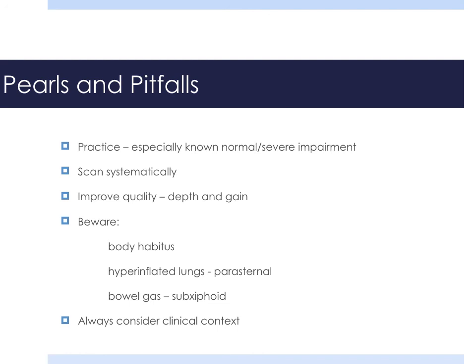Always consider the clinical context. Your scan should be triggered by a clinical question, and it should guide your therapy and guide your management.